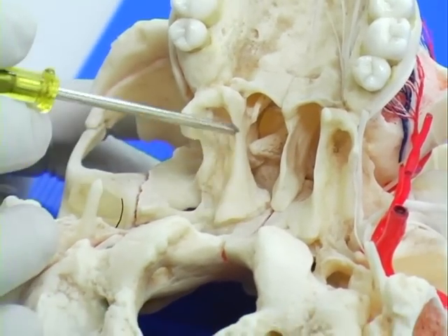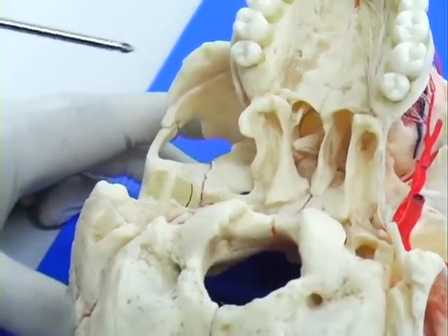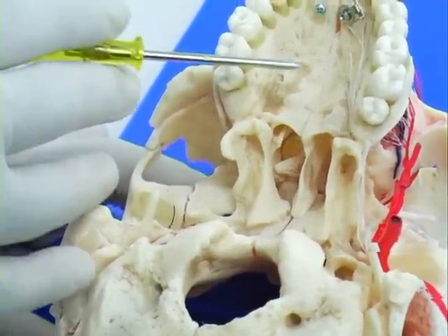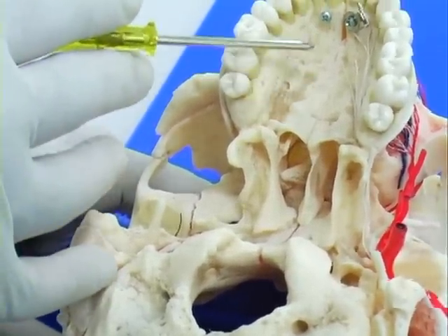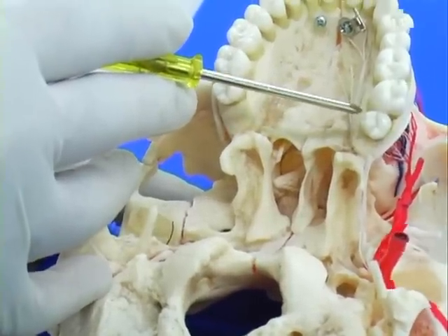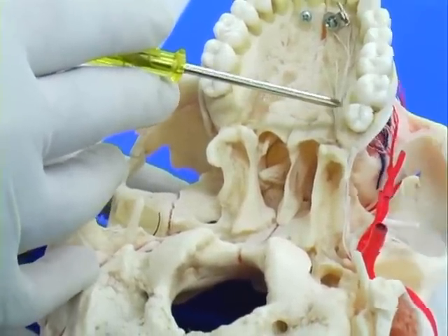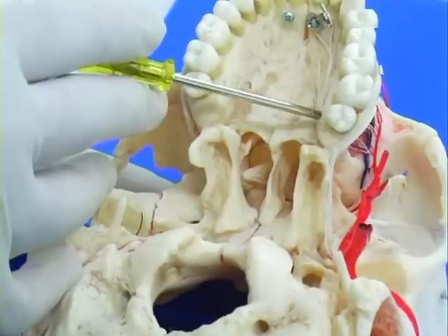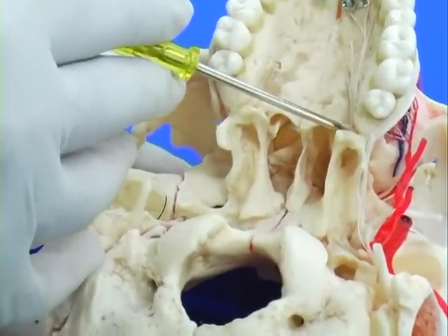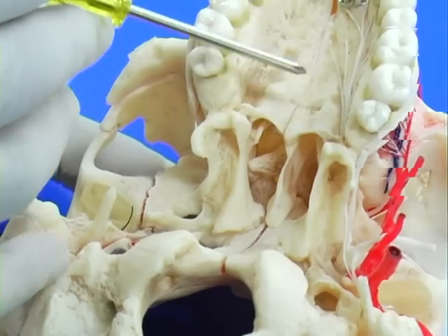Right behind the greater palatine foramen is the lesser palatine foramen, which transmits the nerve to the soft palate. While you are injecting or infiltrating to anesthetize the palatal area, it is important that you should not cross the distal part of the seven; otherwise the lesser palatine nerve will be anesthetized and the patient can gag.